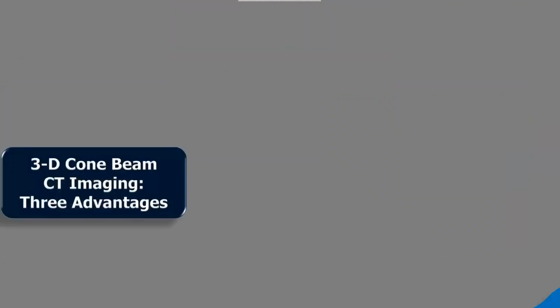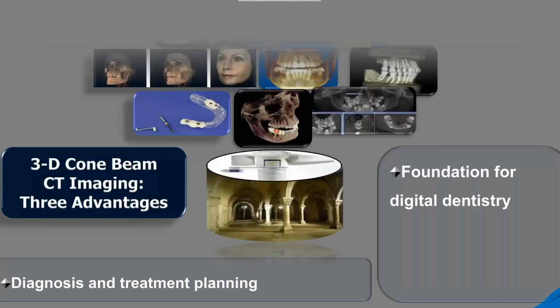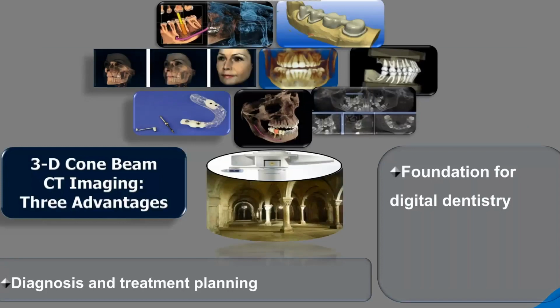All right, when we're talking about our cone-beam CTs, we really have 3 main advantages. Diagnosis and treatment planning is huge. It also becomes the foundation for digital dentistry. This becomes the base of everything else and the jumping off point of everything else you want to do. It's excellent for patient education.